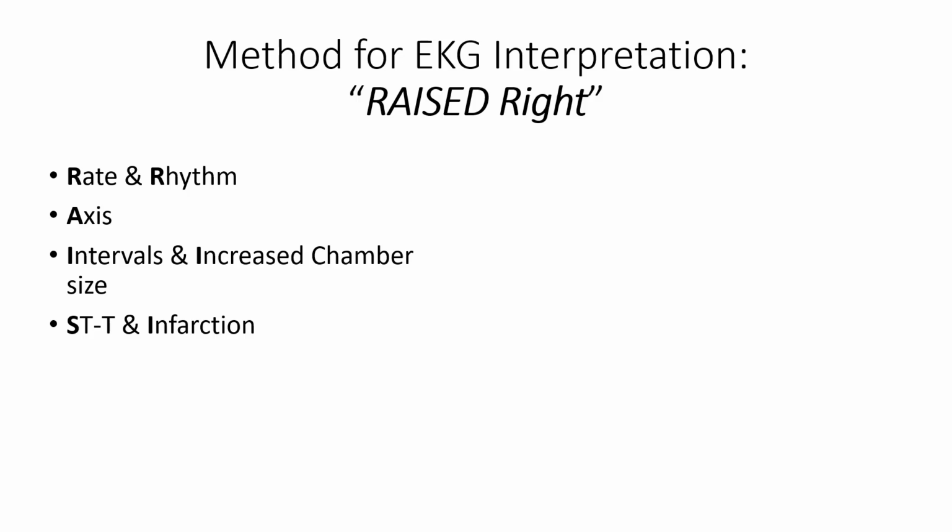Next is the all-important ST segment and T wave analysis, as well as other indicators of infarction. Now, you might be asking yourself, if it's so important to properly assess the ST segments and look for infarction, why is it buried down on number 4 in your list?